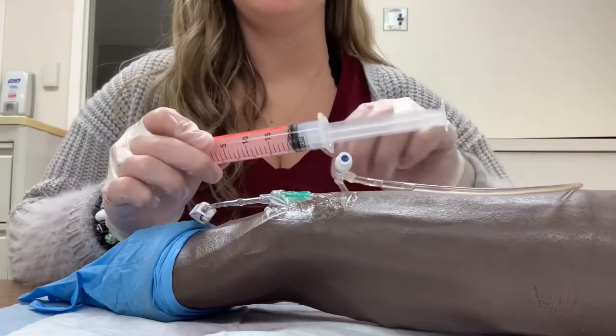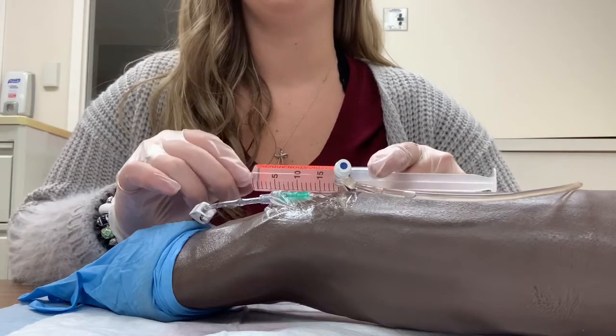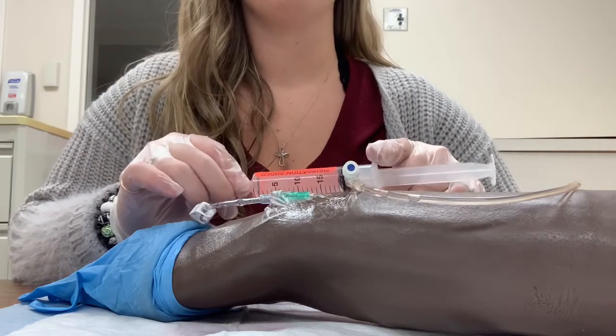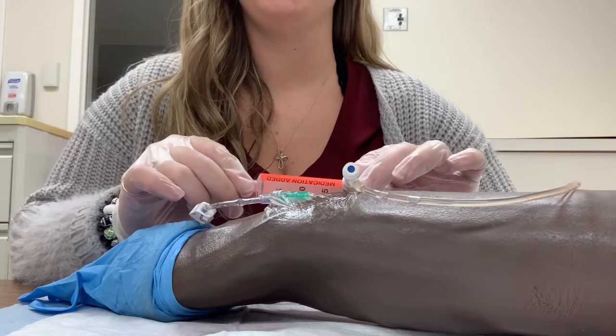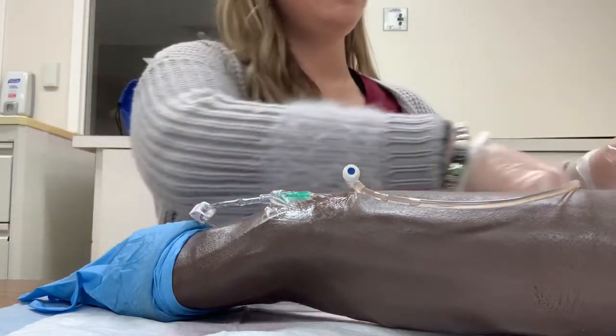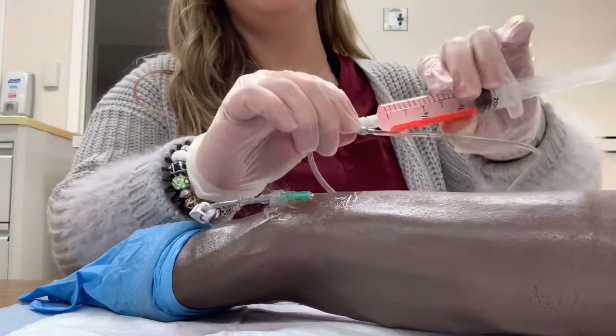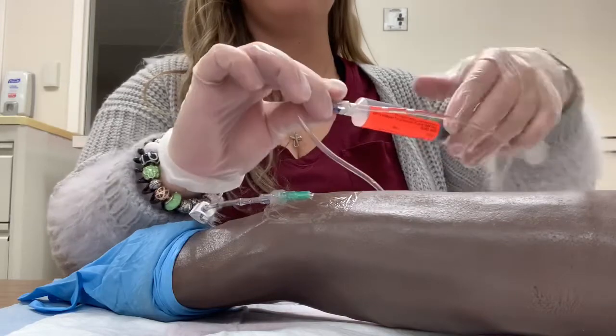I am administering ceftriaxone at a rate of 2.5 milliliters every 15 seconds over a two-minute time period. This drug is compatible and I will be administering it using the pinch-push-release method.